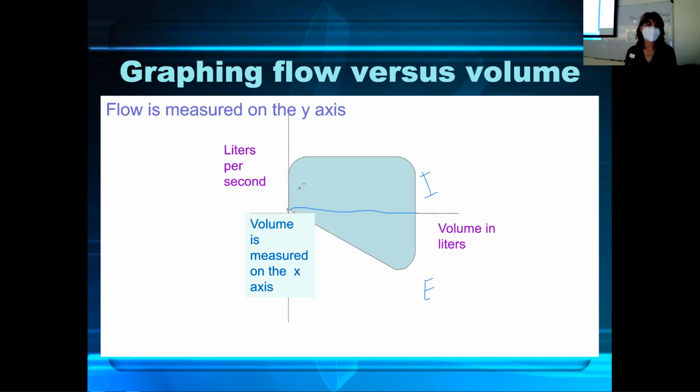All right, so during inspiration, the ventilator will deliver some air to the lungs, and as the air is flowing in, you can tell how fast the flow rate is. So whatever the number is right here for flow. So the air flows into the lungs, and then the exhalation valve opens, and now you have a straight line. And now all of this is exhalation and the air coming back out of the lungs. So air going in, exhalation valve opens, and now air comes back out. So inspiration on top, exhalation on the bottom.